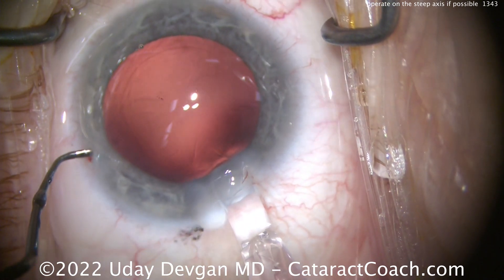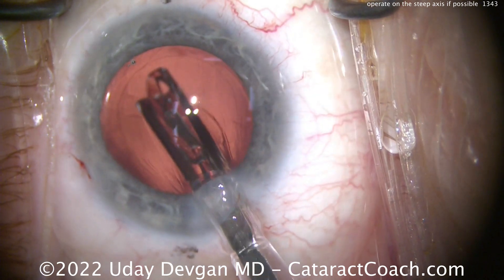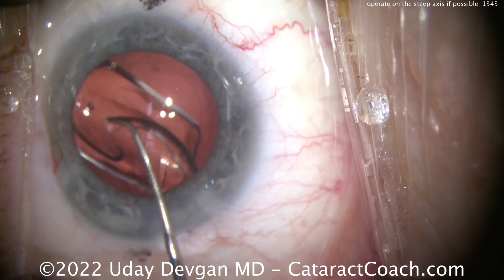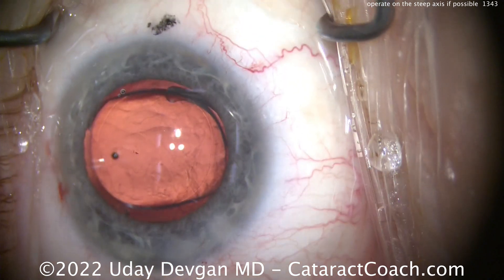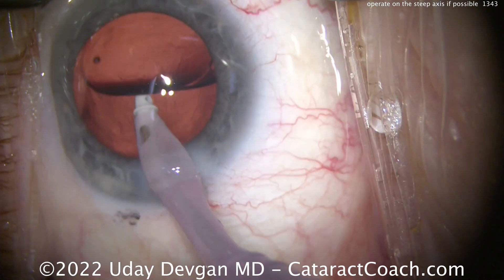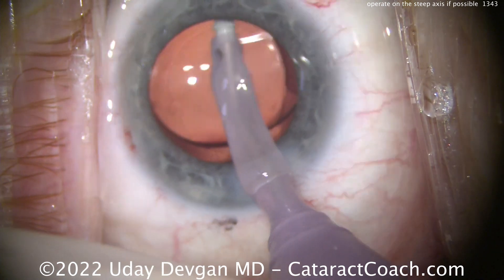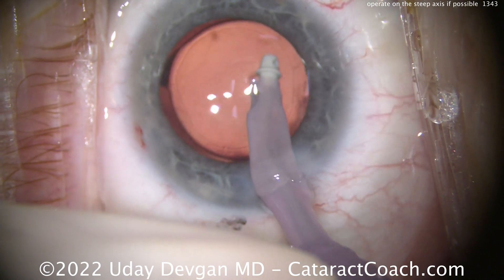That's why I always implore you: take pride in your incision, make your incision as good as possible, and take the next step — make the incision in a place where it benefits the patient the most. Don't place your incision at some oblique angle just because it feels better for your hand for the five minutes you're operating; that doesn't make a lot of sense. Our surgery changes the way the patient sees the world every waking moment forever. If it's a very tough case and you need to access a particular area, fine — but for your routine run-of-the-mill cases where you're looking for a clean refractive outcome, definitely help benefit the patient.